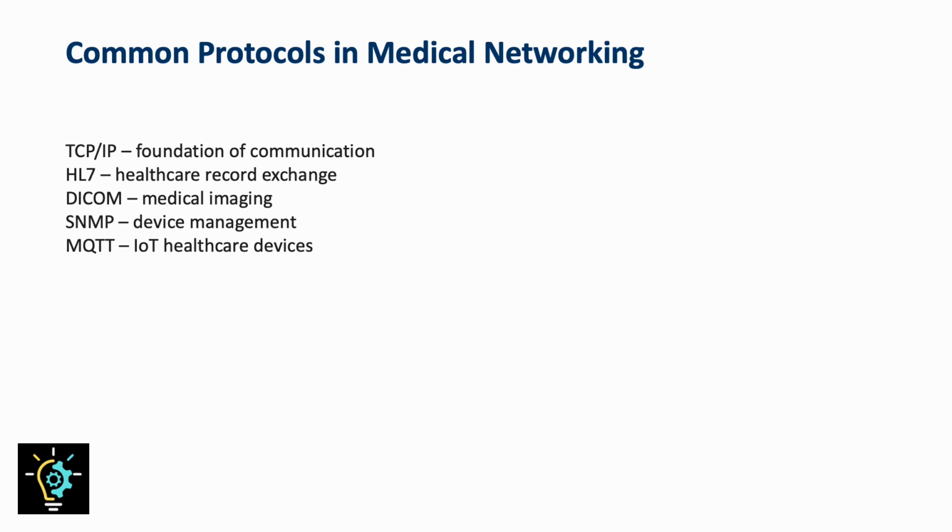Other protocols include SNMP, which helps manage devices on a network, and MQTT, which is a lightweight protocol that's gaining a bit of traction in IoT-based healthcare devices. Each has its strengths and limitations, and understanding when to use them is key to designing reliable, interoperable medical technologies.